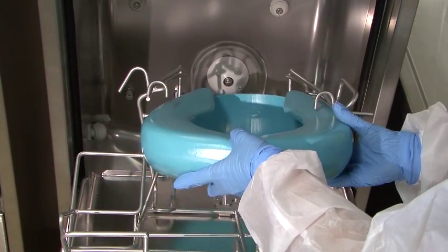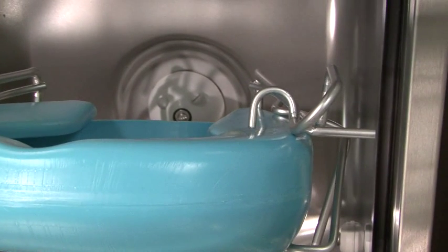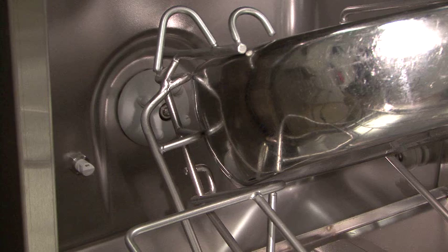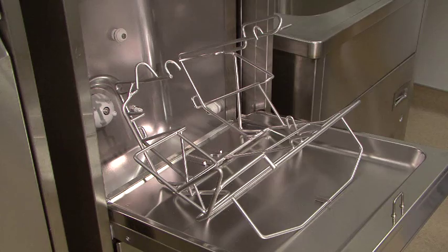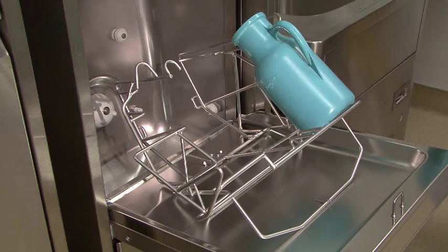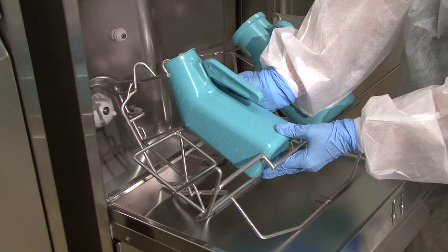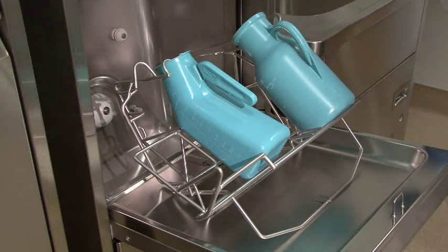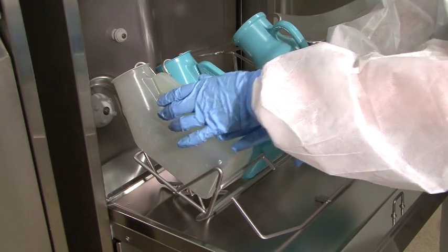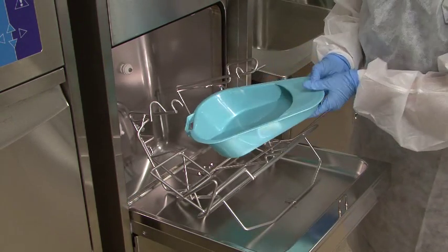Plastic bedpans fit securely in the rack. Stainless steel bedpans fit the same way. Urinals can be washed up to three at a time. Place the urinal opening into the hook, then seat the urinal downward in the rack holder with the handle facing up. Use the left hand side of the rack for a single urinal. Slipper pans fit in the rack wide end first.